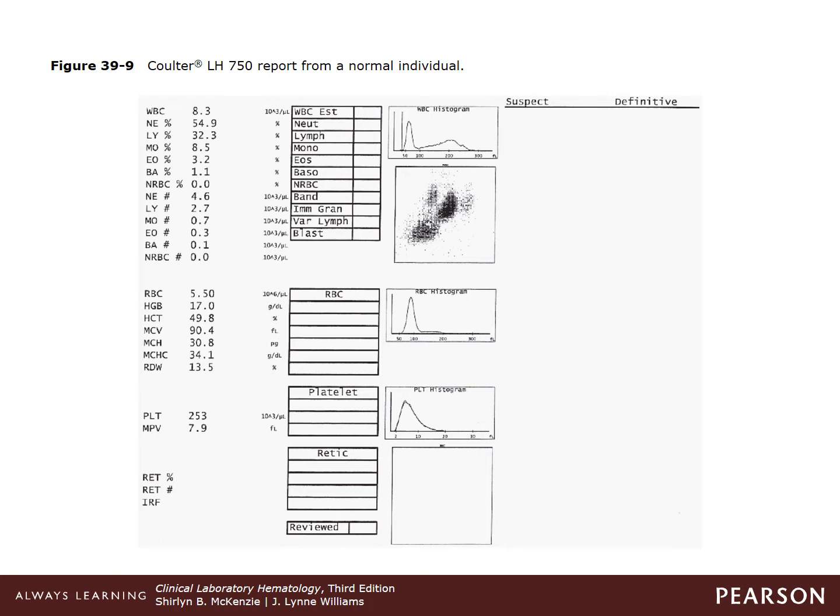Each of these dots is a cell. So we have lymphocytes, and in the Coulter, basophils are behind here so you cannot see them. But we also have monocytes, neutrophils, and eosinophils. Now here, if nucleated red blood cells are suspected, they will be determined by the computer system by looking at the white cell histogram that's generated through impedance and the presence of cells to the left of the lymphocyte. If both plots indicate that nucleated red cells are present, the computer system will evaluate the combination to rule out giant platelets or small lymphocytes.